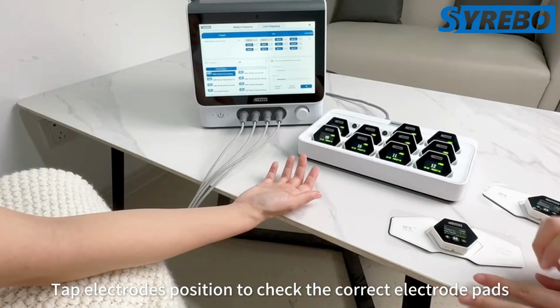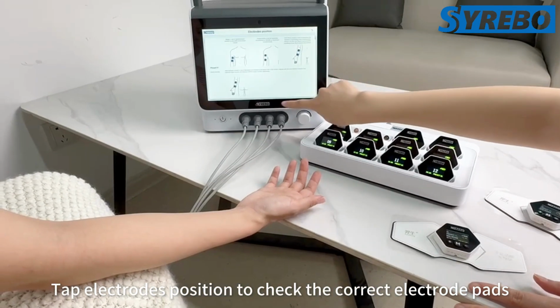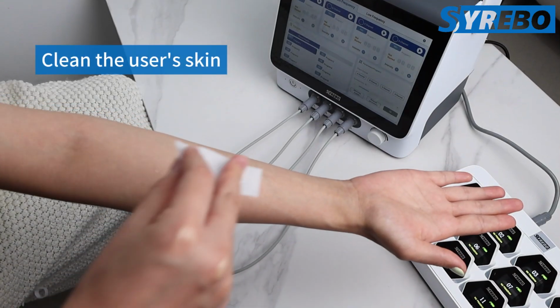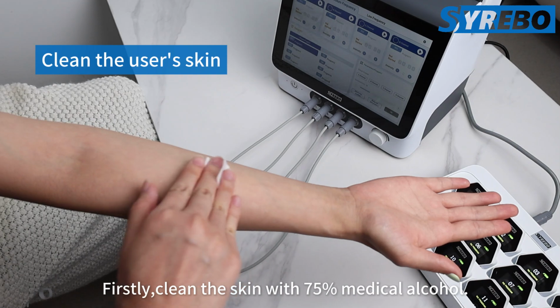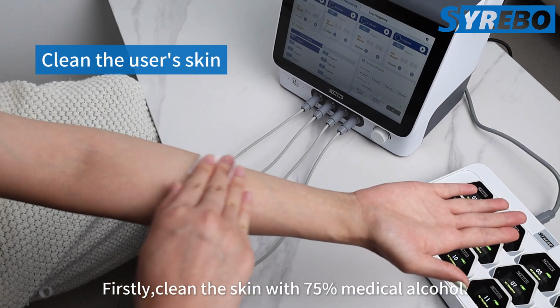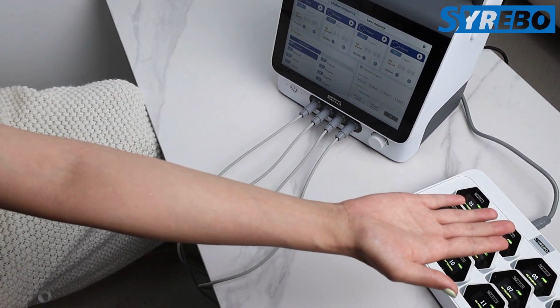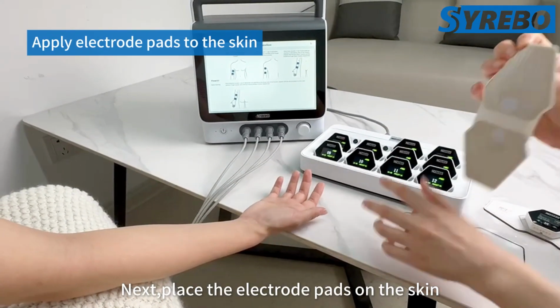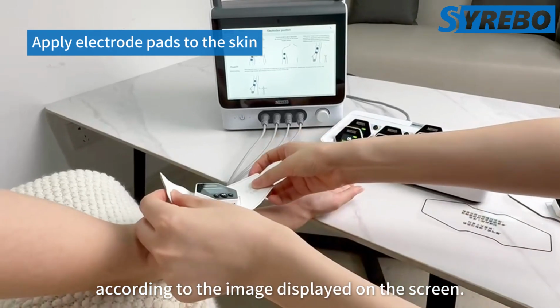Tap electrode's position to check the correct electrode pads placement for the selected program. Firstly, clean the skin with 75% medical alcohol. Next, place the electrode pads on the skin, according to the image displayed on the screen.